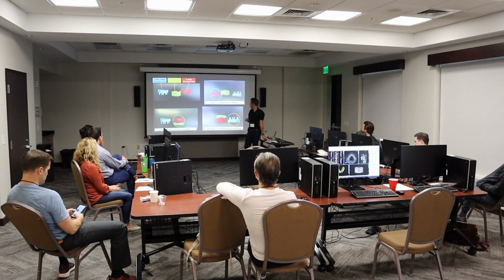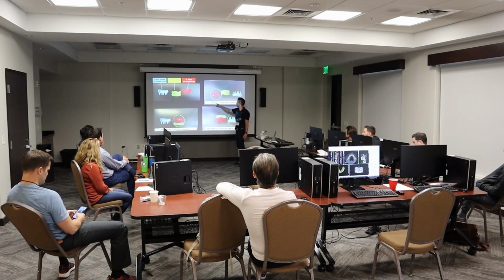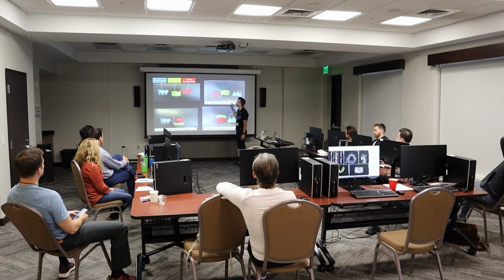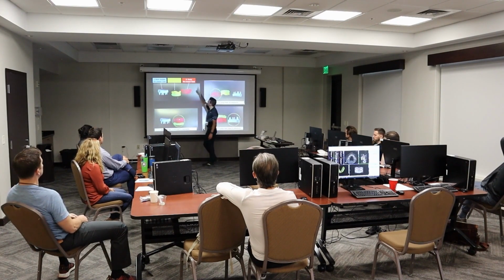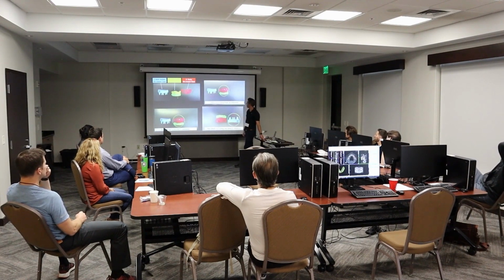Okay, so watch this process, because I kind of tried to break it down. We're going to go into this slide. I'm going to hit play here and watch a video. But watch it stitch number 3 to number 2 using the teeth. So remember, 3 to 2. It's going to take that scan and use the teeth as data. So the red is going to go right over the yellow, and it's going to stitch with that yellow.